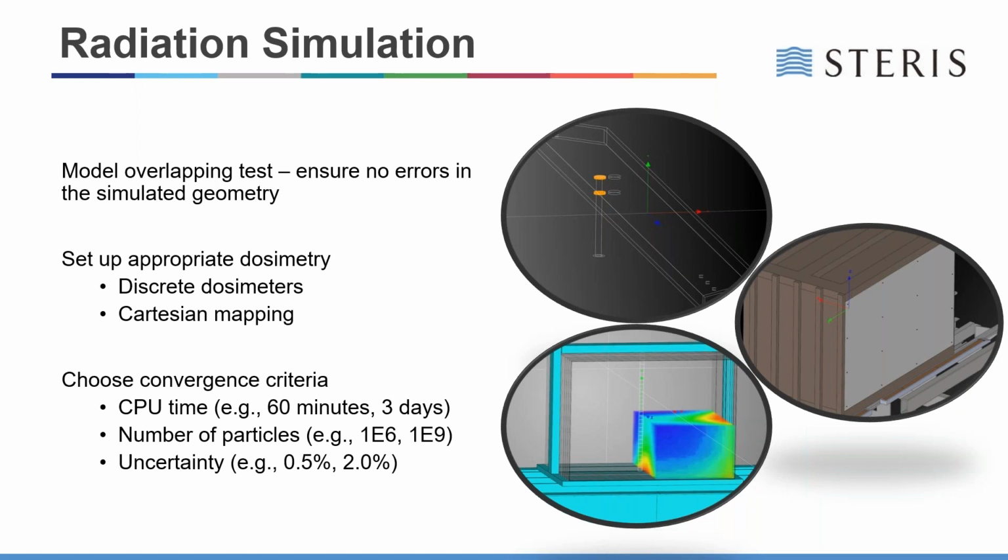Now, this is very powerful because once we've benchmarked the simulation model, that allows for interpolation beyond the set measurement points shown. And if you look down here in the final image on the bottom, what we have now is a quarter section view of the phantom that was irradiated, isolated to fully visualize the dose penetration and the distribution within the interior.